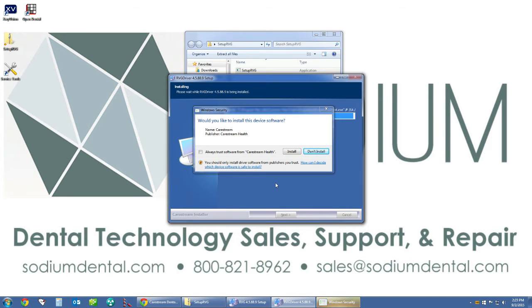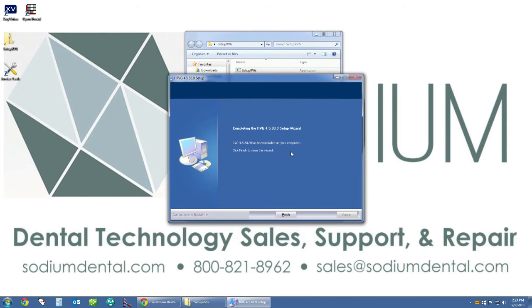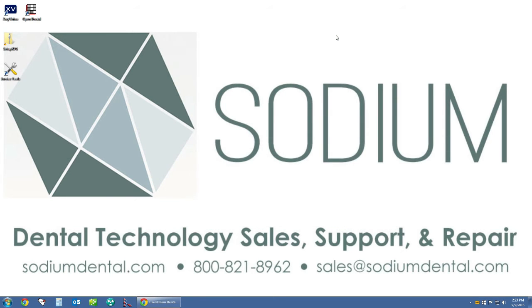At this point Windows security may prompt you whether or not you want to install the CareStream software — go ahead and click install. Again, click install. Now that the installation has completed we can click finish. We can go ahead and close out our RVG folder.